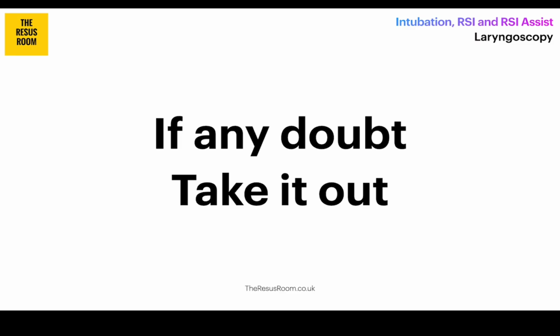Also a personal opinion, but I would say that it's only at this point of actually confirming that you're in the right place is it worth taking the blade out. Because if there's any fine adjustment, such as you've gone a little bit too deep, you need to withdraw the tube, you need to do that under direct vision. And if you've taken the blade out, that's going to be a right faff to try and get that back in there. So you might as well establish that you're in the right place at the right depth, and only then at that point take the blade out.